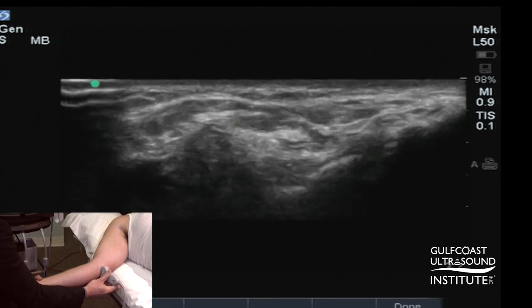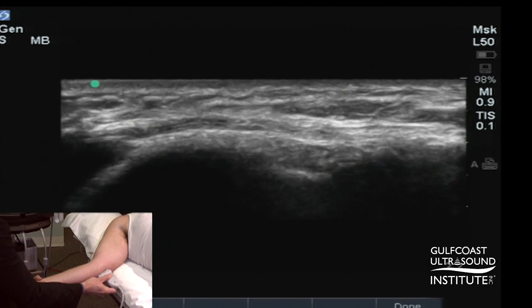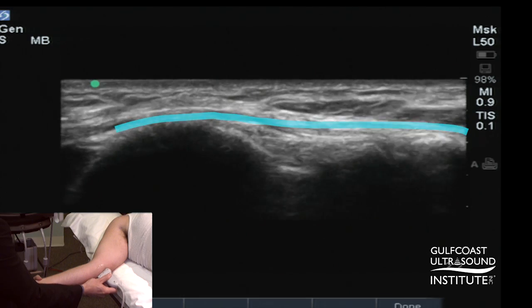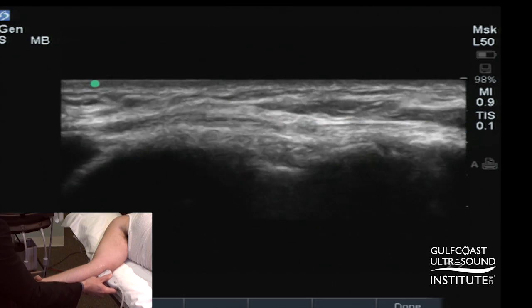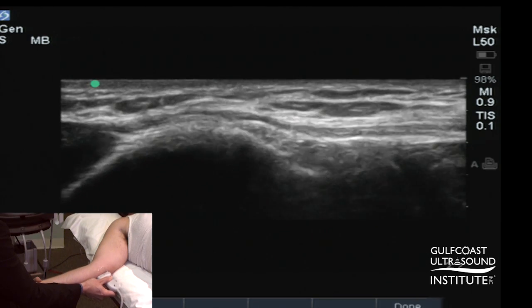We can also look at the ulnar nerve in long axis, as shown here. Often this is difficult, as the nerve is not always in one single imaging plane.